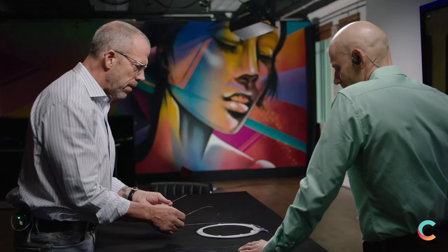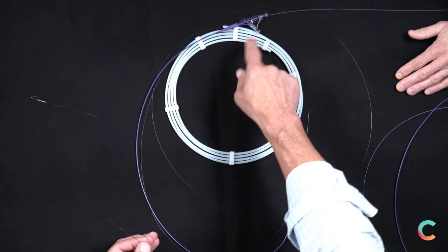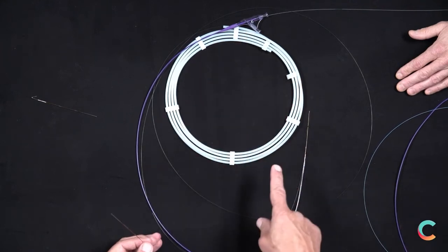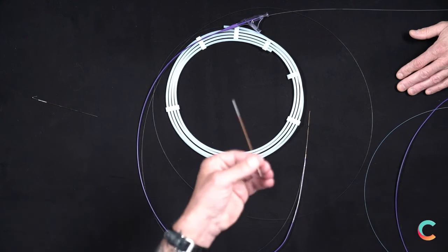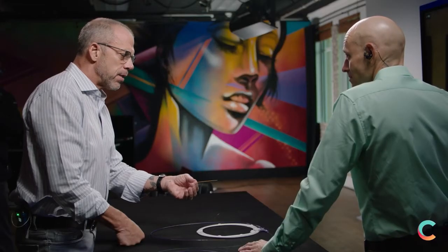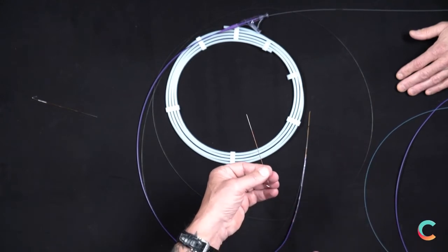And so, the great additions by Gary on the clinical side. But now when we're talking about cost, instead of having 17 of these sitting on the floor somewhere, now my rapid exchange is really at the distal tip where I'm applying the therapy to the patient, and the rest of it is just the rails being delivered on. That's right.